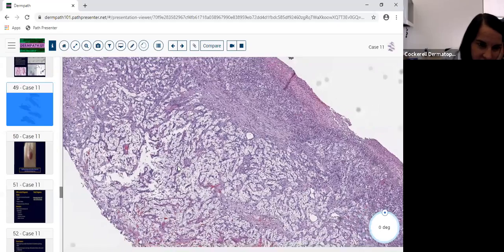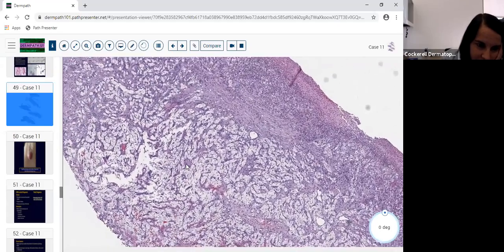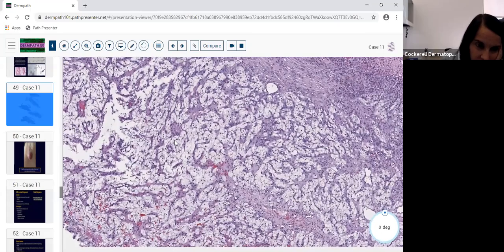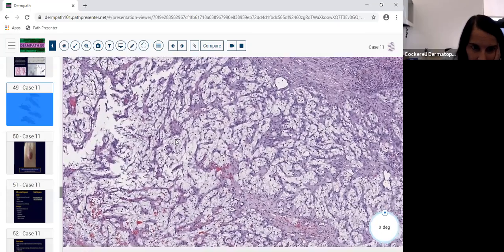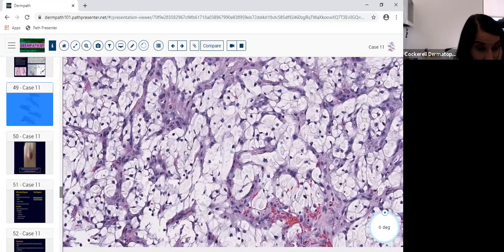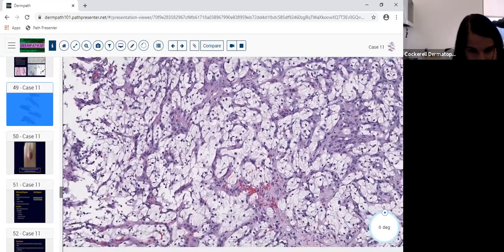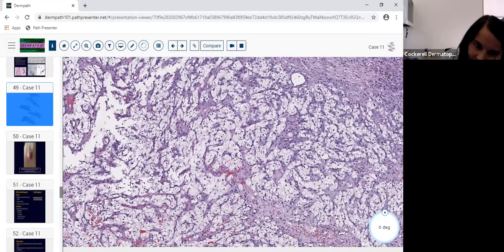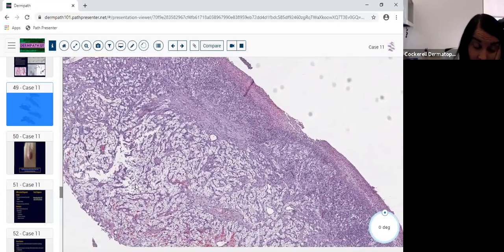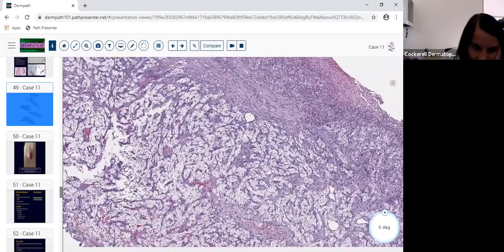So we do need to think about a met. Well, could this be a met from the lung? No, because when an adenocarcinoma metastasizes from the lung, it's usually more poorly differentiated. The NC ratios are usually much higher, and you will actually see gland formation, and you won't see this arborizing vascular network typically. Also, you could do a TTF, and you could say, well, it's not lung.